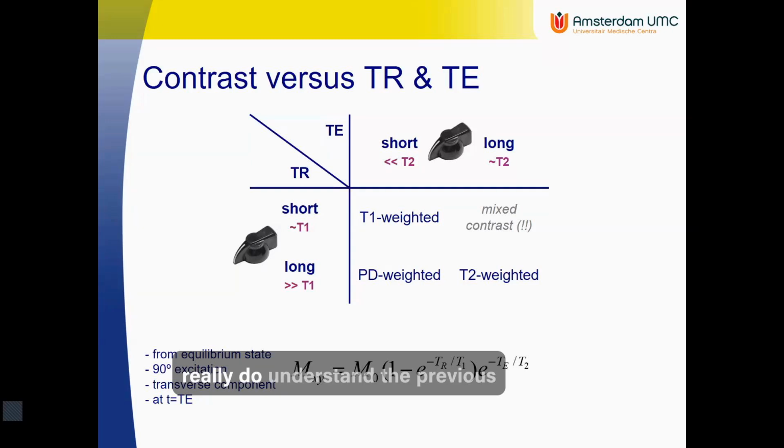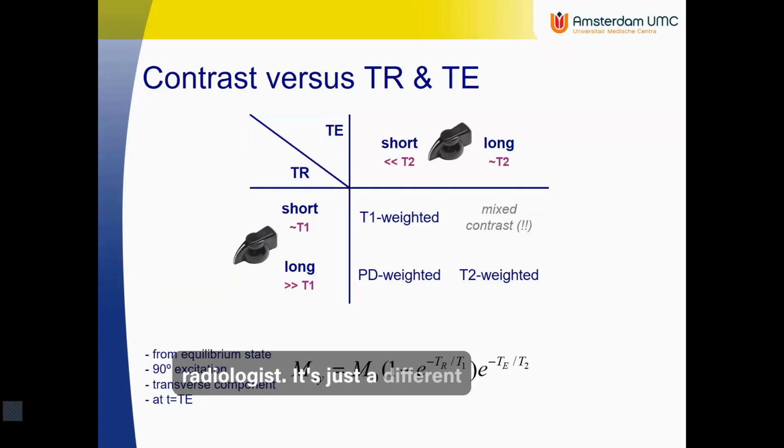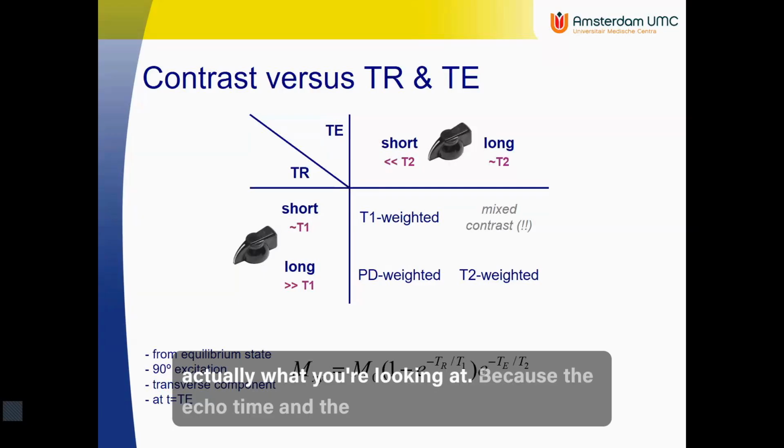Some really do understand the previous slide and they can think about optimizing sequences and what you can do. Other radiologists just look at the images and know all the procedures. Doesn't make them better or less good, it's just a different way of thinking. But you would have to remember this table to understand what you're looking at.